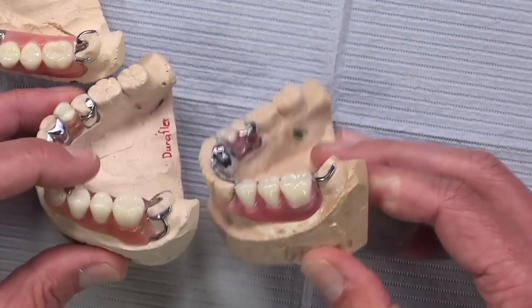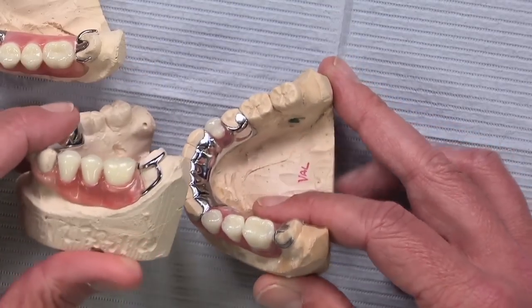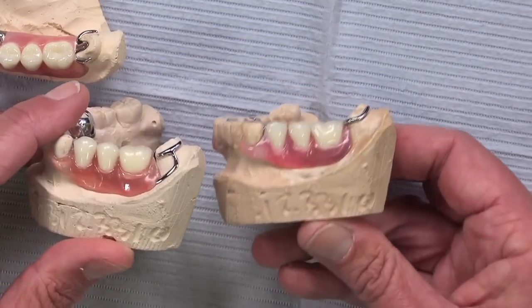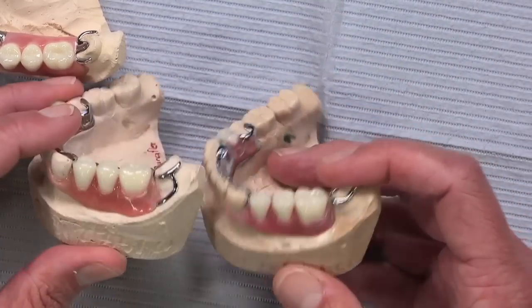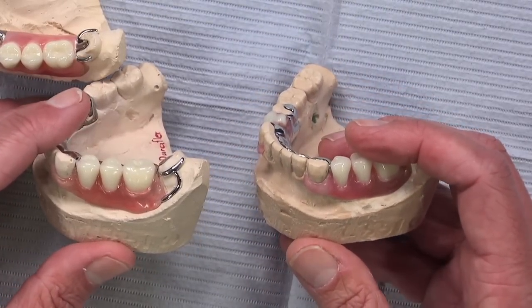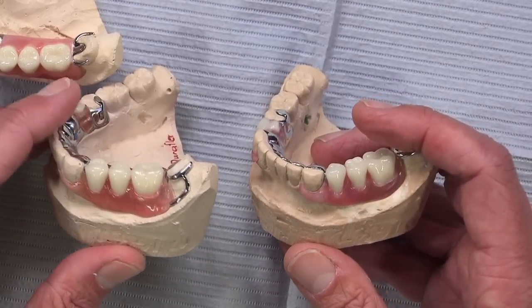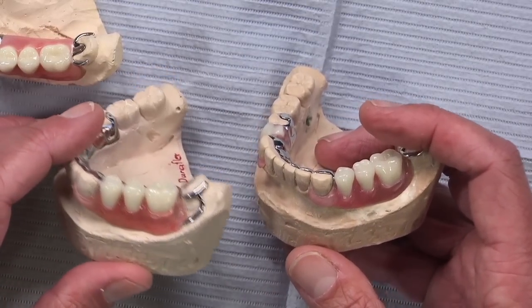And I realize it's a little difficult since there isn't a shade guide for that, how to know to ask for the dark or the light. So I typically will just send a picture of the patient's gingiva in when doing either a Duraflex or a Valplast partial to give them a better idea of what we're trying to match. We can't hit it perfectly, but the more translucent it is, the better it's going to look.